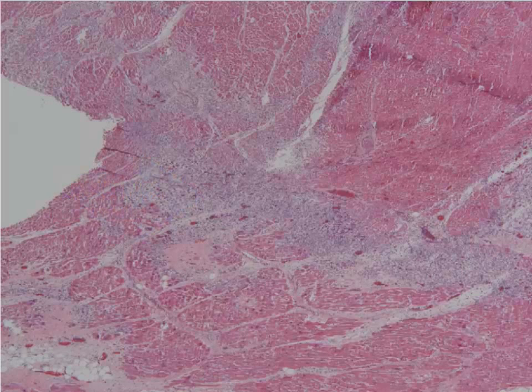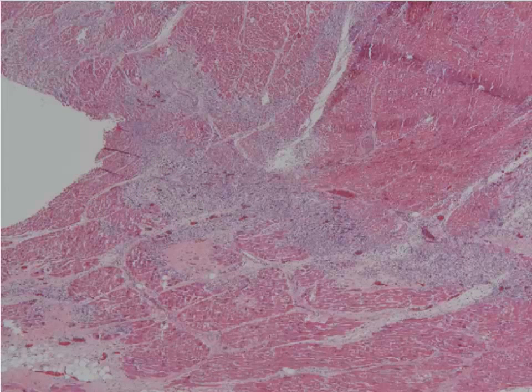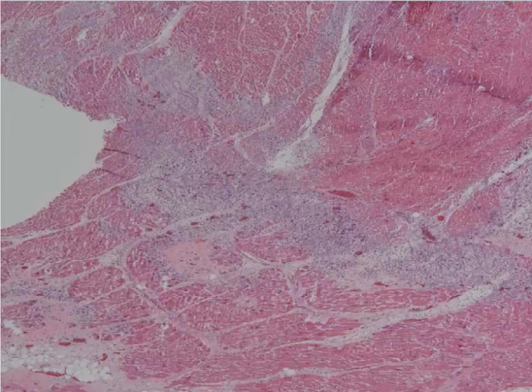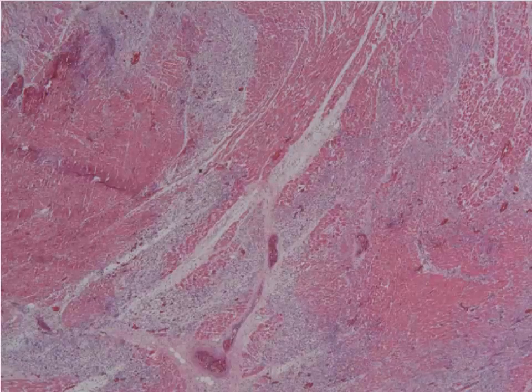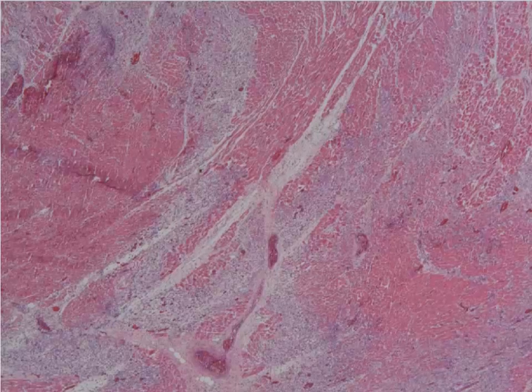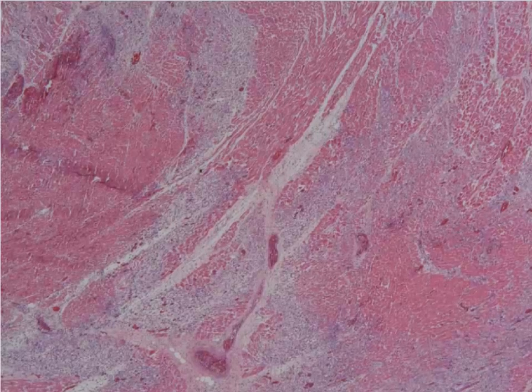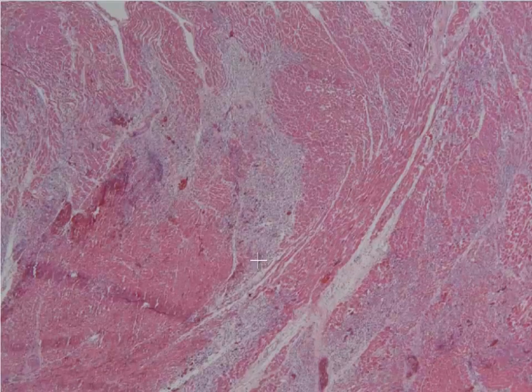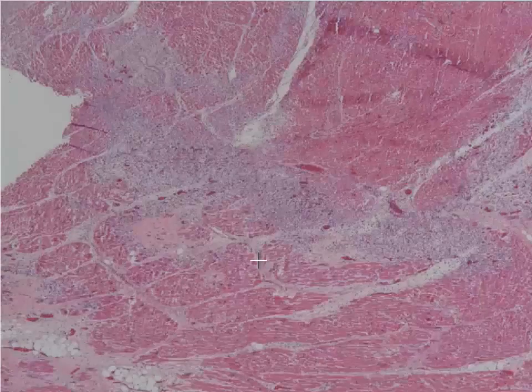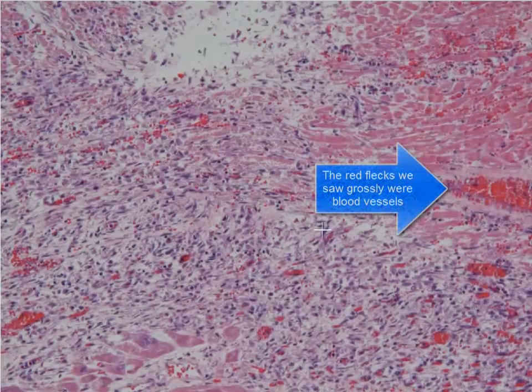His initial heart attack happened about seven days before he passed away, and this is a section of his heart muscle. What we saw grossly was kind of an area that looked yellow to tan - a little bit more tan than anything with little red flecks in it. You can see lots of normal heart muscle here, well somewhat normal, and there are these areas that appear lighter. When we go down and take a closer look at these areas, you will see that this is actually granulation tissue.